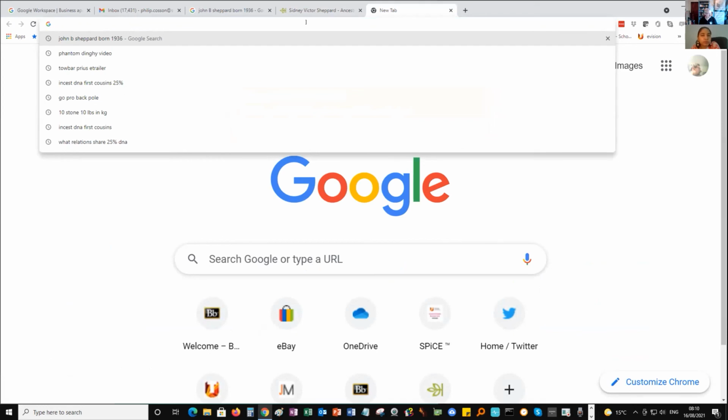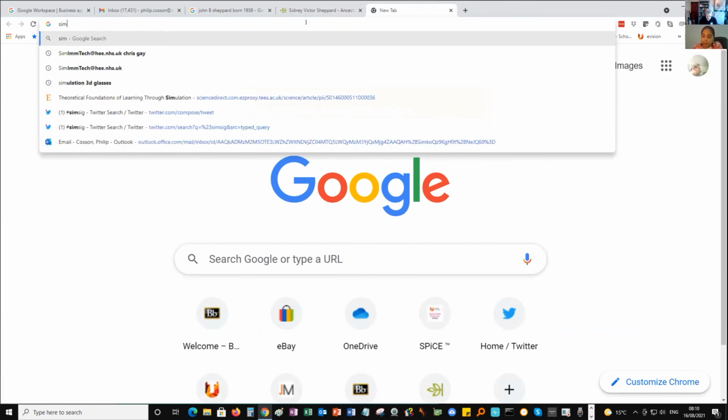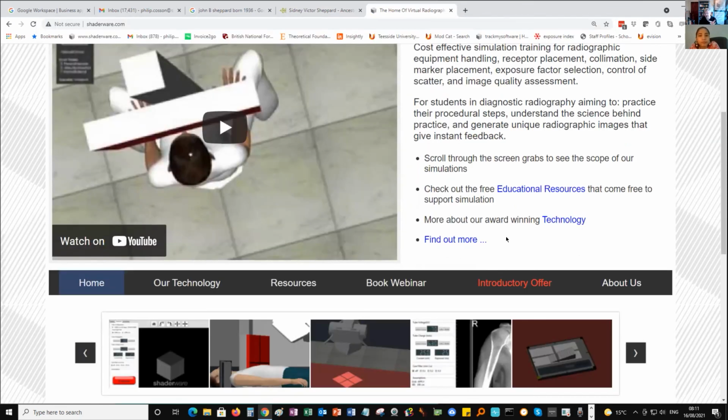Lots of universities start small. We've had universities buy three times from us. They buy once for a few to check it out, then maybe buy some more when they get some more money, and then maybe buy big when they get a big grant come in or something. So this is being paid individually, like per person? Yeah, and you just multiply that up.